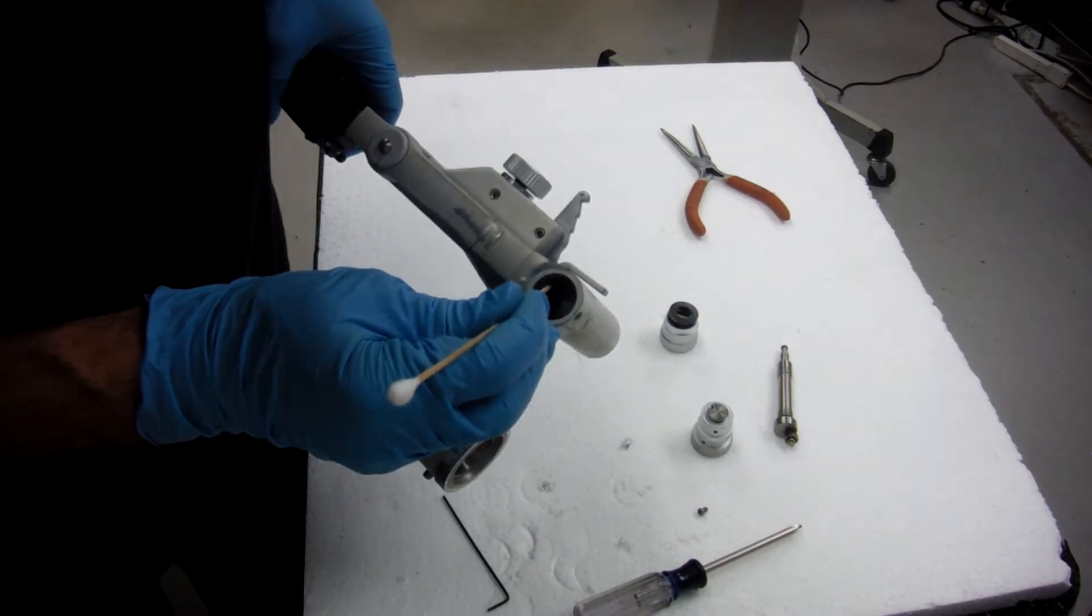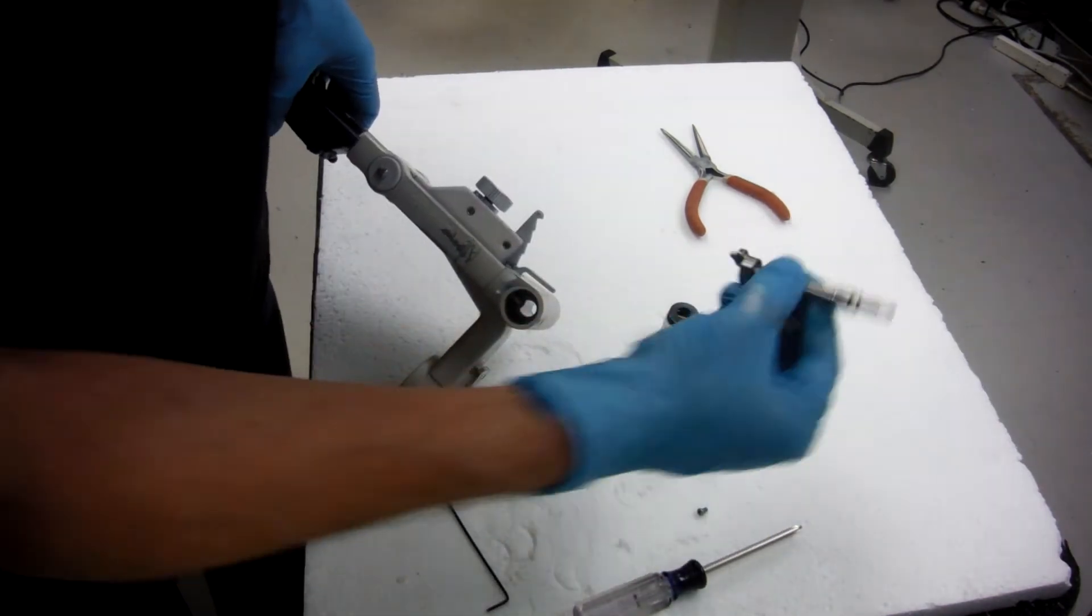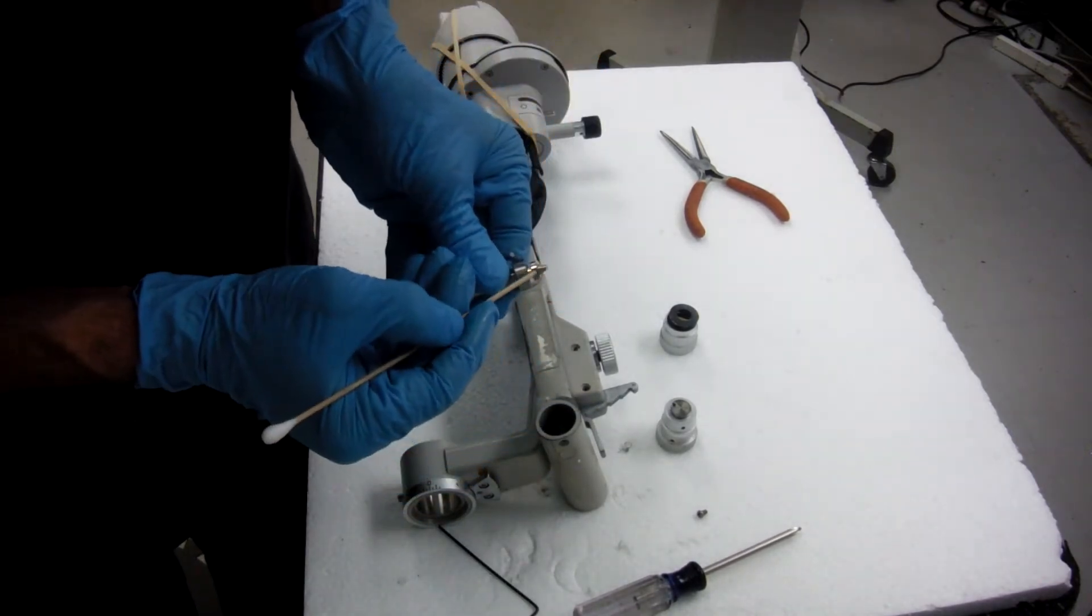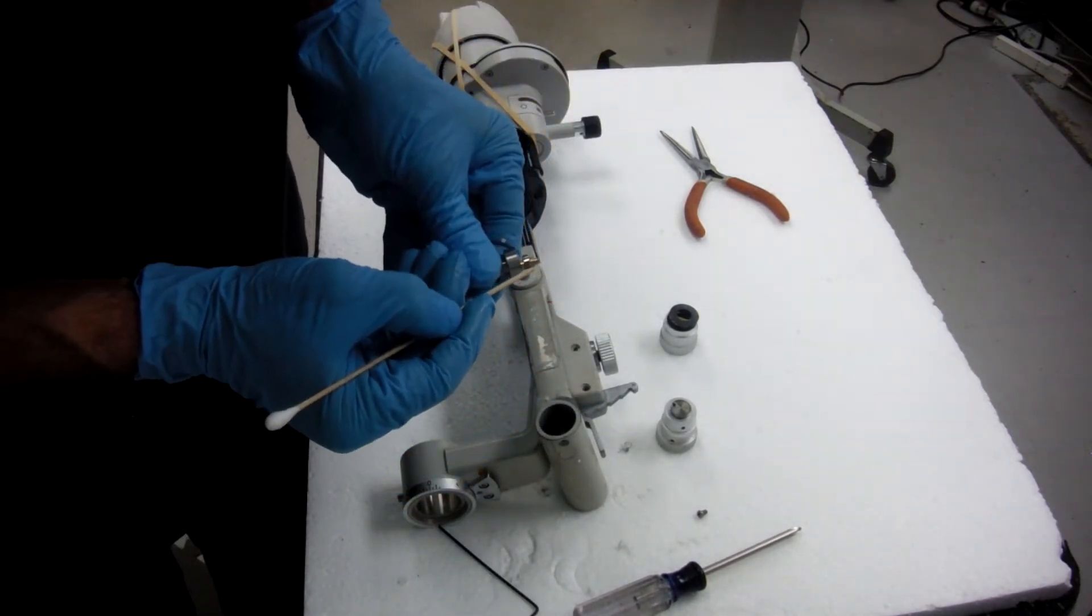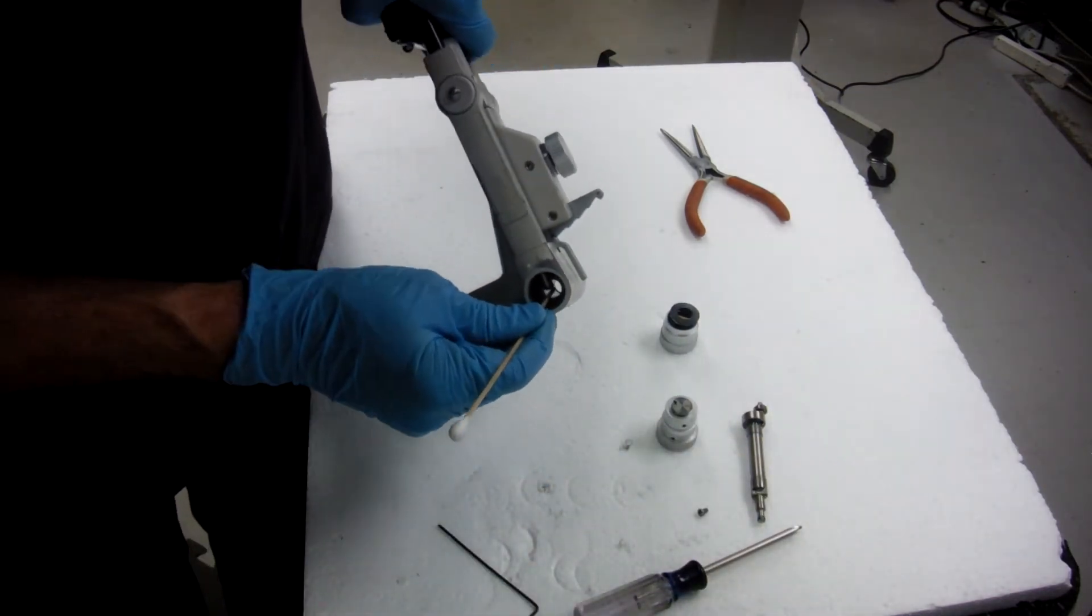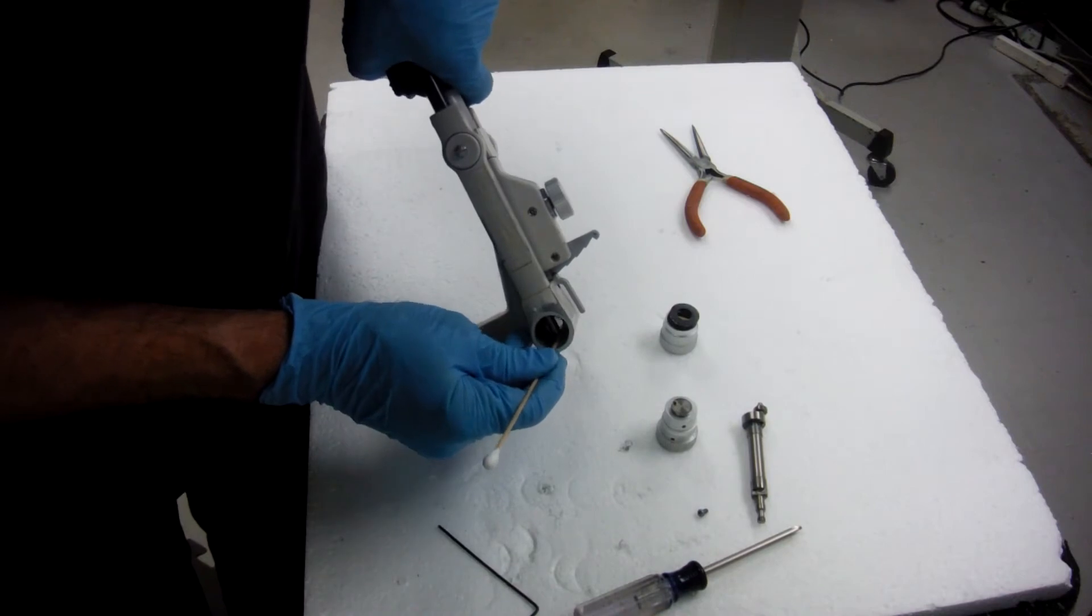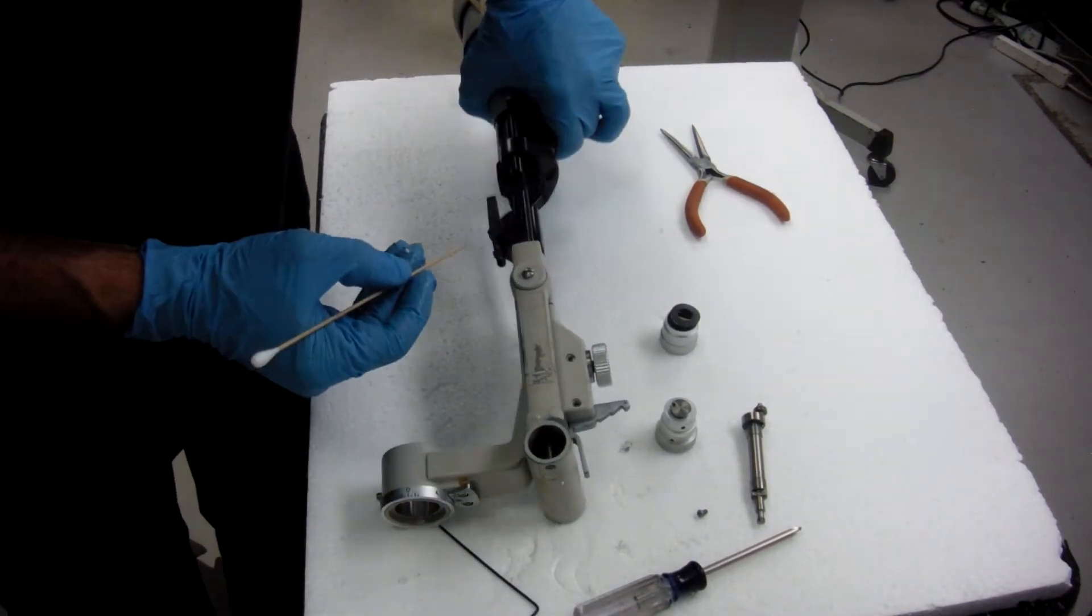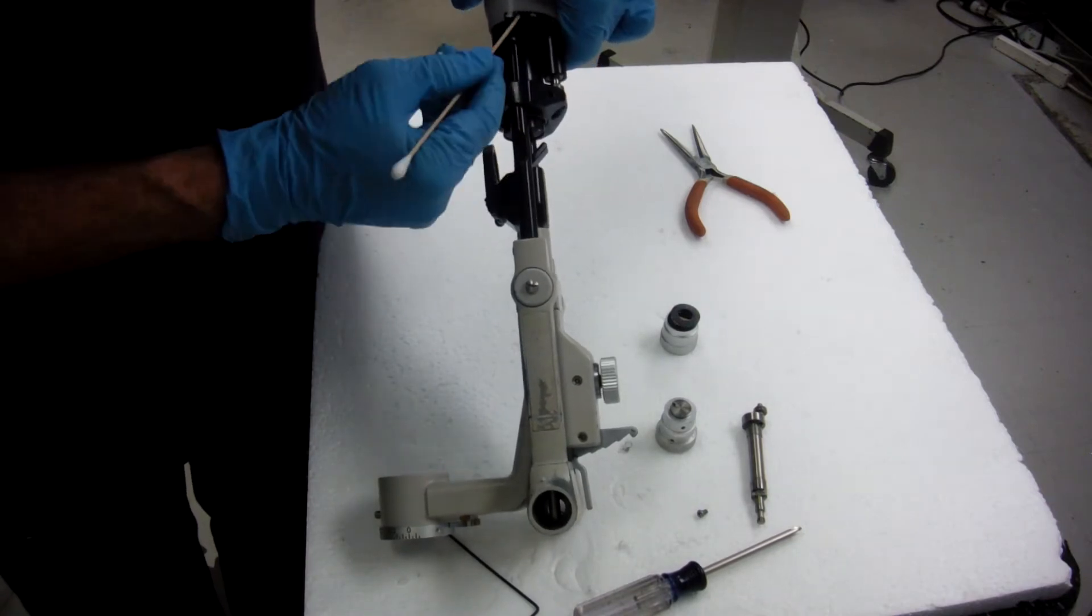Inside here you have this pin that rides on this bearing. When it goes up and down, it pushes this pin up and down, which pushes the rod, which pushes your table.